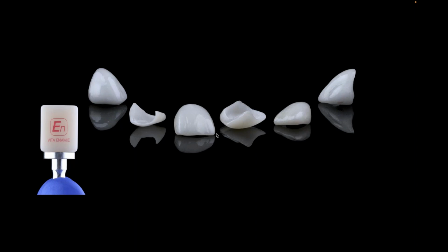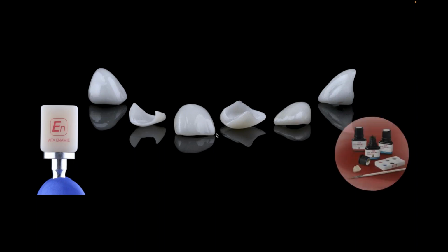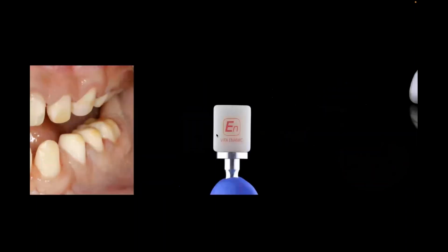When I have a young patient who either has an issue with the size of their teeth, or they broke or chipped something, and they still have a lot of maturing and growing to do, these veneers actually work well. I mill these, and then I can just stain on them. So nothing is fired, everything is milled, stained, hand texturized and stained up and light cured. So it's kind of an easier system.